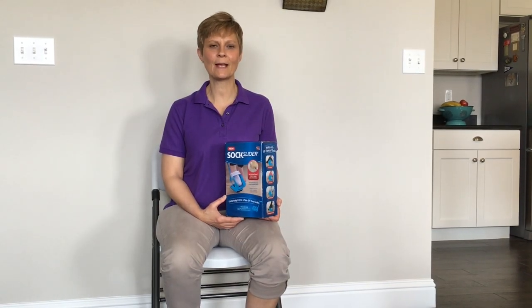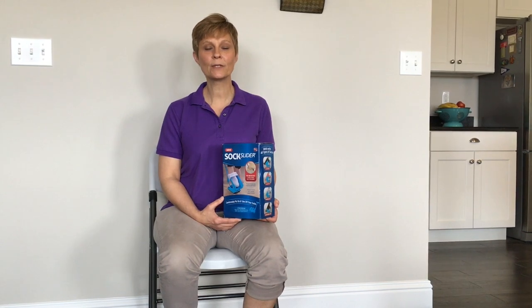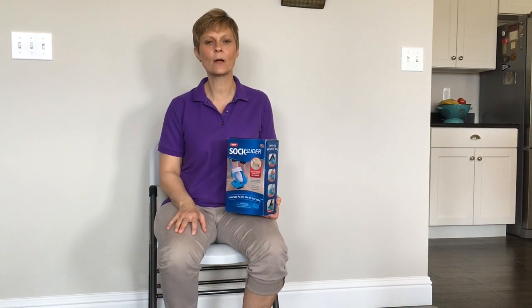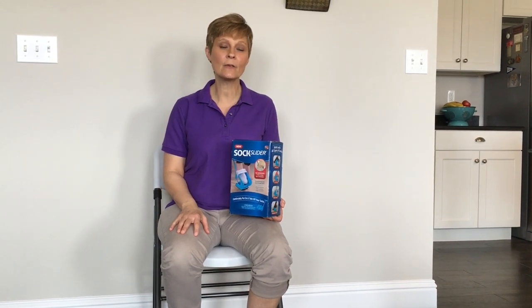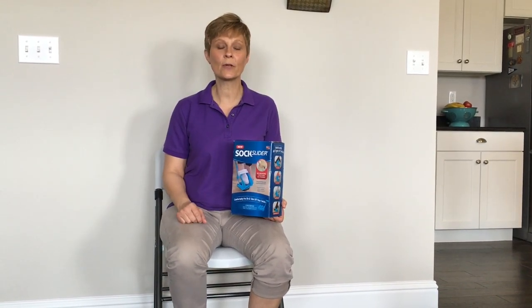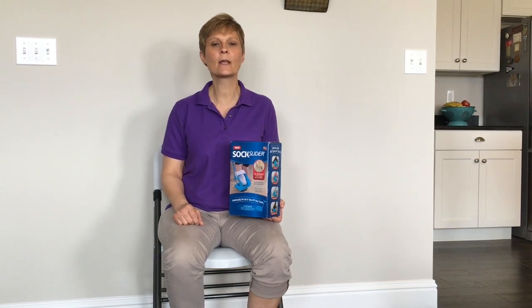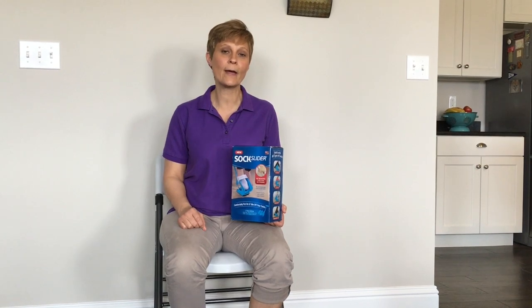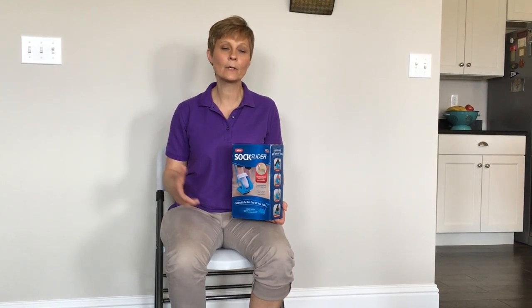Hi, Cindy here, physical therapist with Adaptive Equipment Corner. Today we're going to do a review of a product called the Sock Slider, and that's what I have here sitting on my lap. I saw this on TV and wanted to get it to see what it was like. I work with occupational therapists, and with a lot of our clients, they work with them on dressing, and one of the things that they include with that is how to put on their shoes and socks. So there are a lot of sock aids out there, and I wanted to get this one in particular to see how it worked.